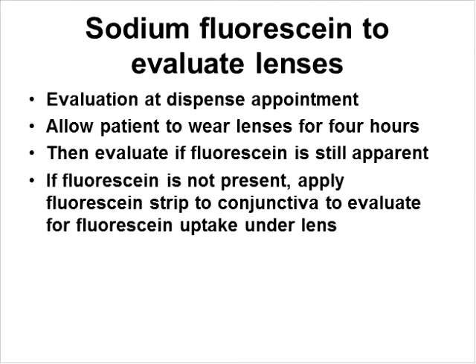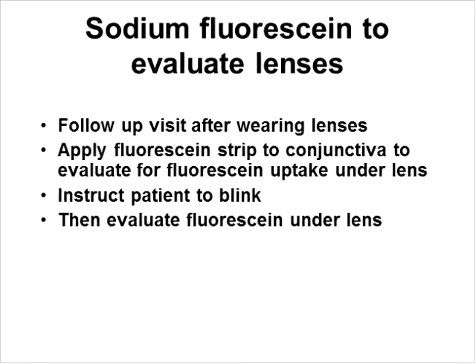At the dispense appointment, allow the patient to wear the lenses for at least 4 hours. So I like to see the patients in the morning and then again in the afternoon after about 4 hours to reevaluate the fit of the lens. First, evaluate if fluorescein is still present, and if it's not, apply the strip to the conjunctiva to evaluate for fluorescein uptake under the lens.